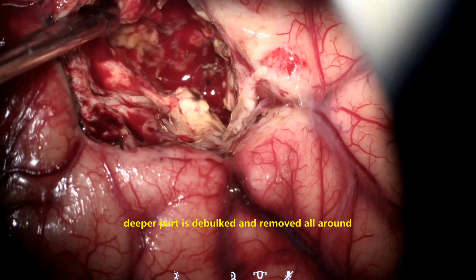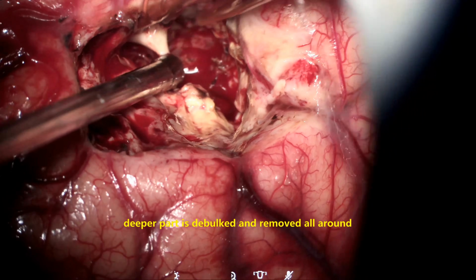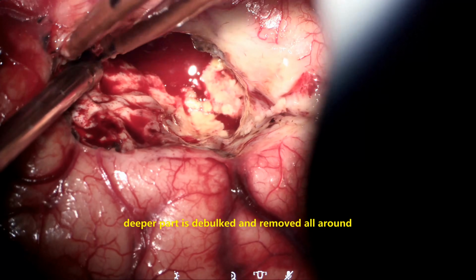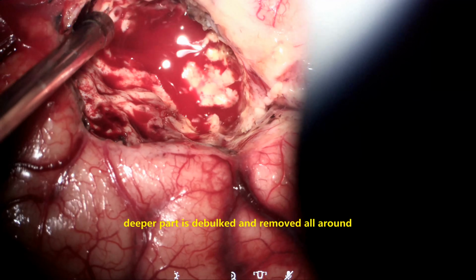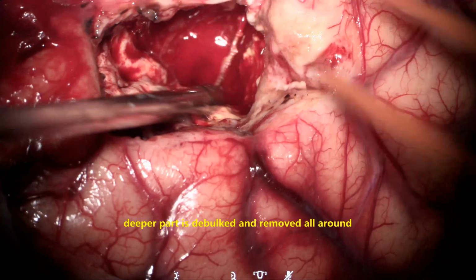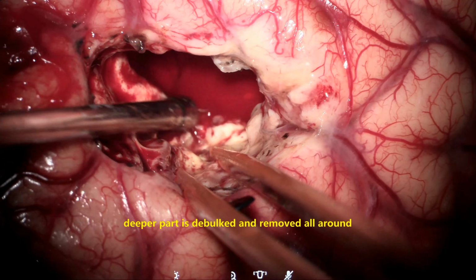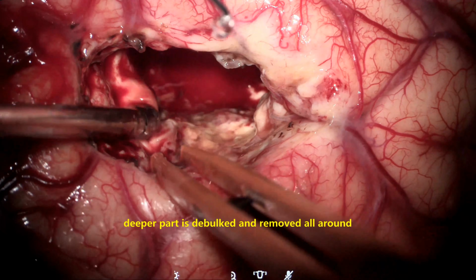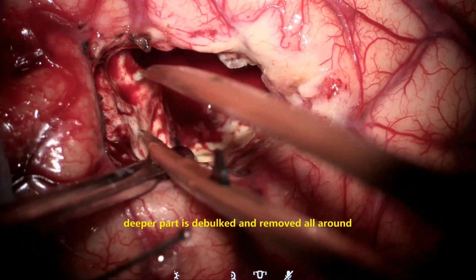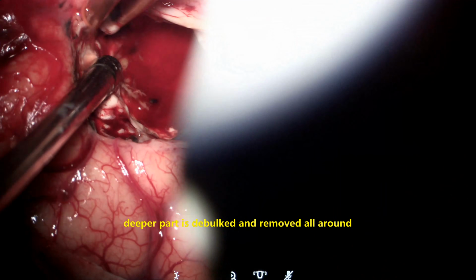Now you see, as we keep going deeper and deeper, the necrotic tumor starts appearing, and you can see the tumor with vascularity, the blood vessels coming from the branches as I mentioned to you. At every stage, these vessels need to be coagulated, proceeding circumferentially like descending a staircase or in a pyramidal fashion, and keep coagulating and debulking the lesion.